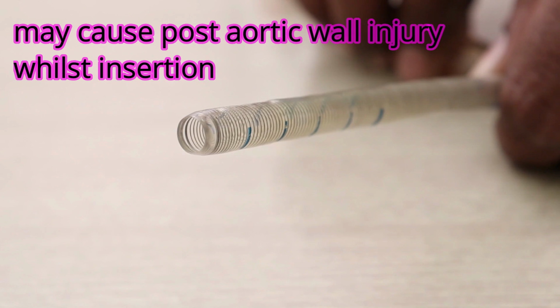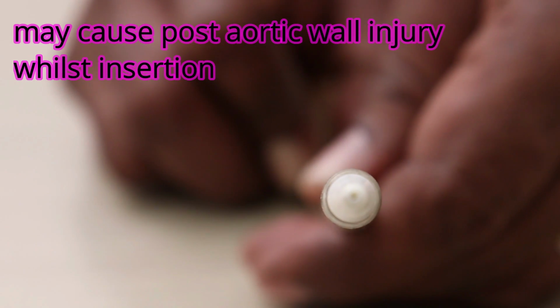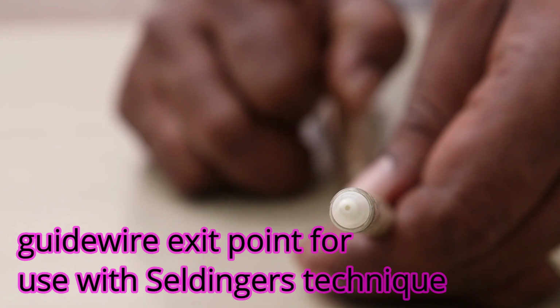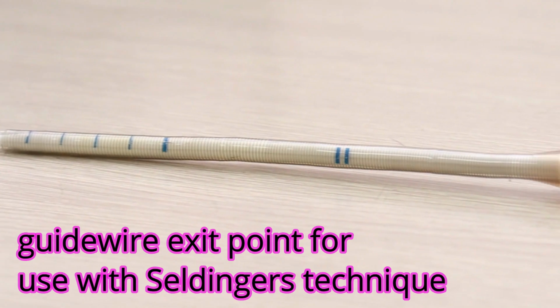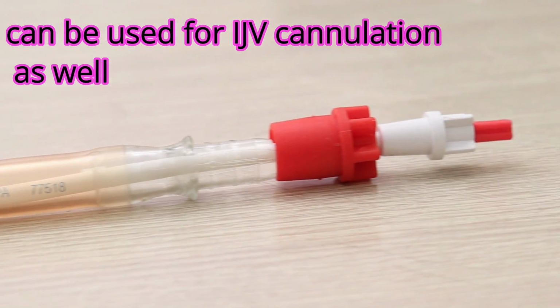So you have to keep an eye on the marker regarding how deep you are in the ascending aorta. Now you can use it by the Seldinger technique as well if you are using this, so you can use a guide wire and then set the cannula over the guide wire.